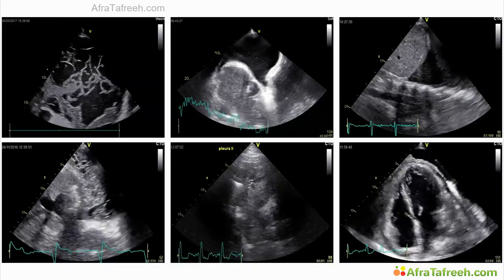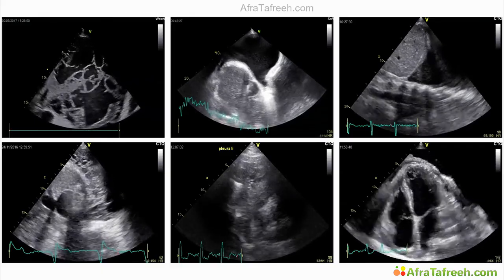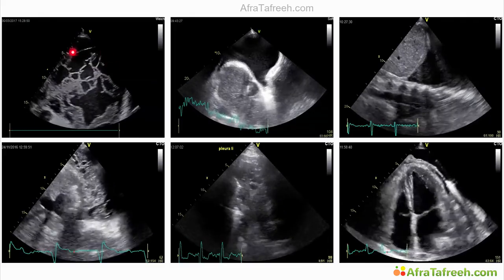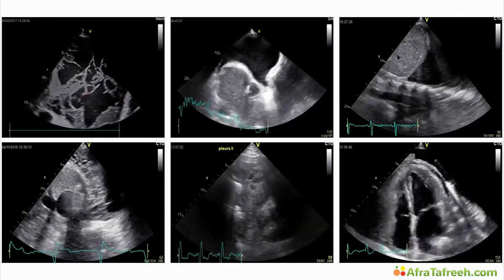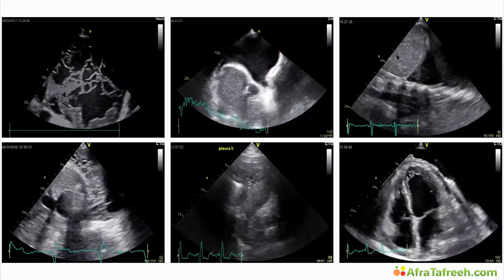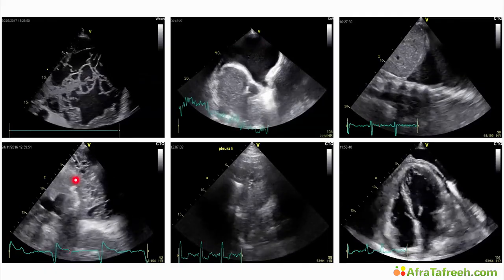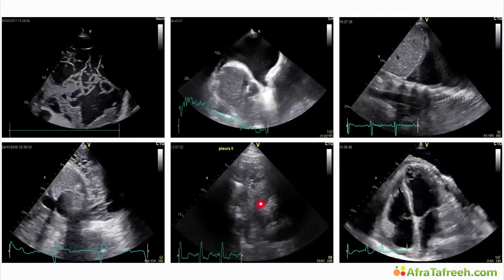Here are some other images that we took with another machine. Look how bizarre these pleural effusions at times can look. This is an exudate. Here you would have an echolucent effusion. This is a transudate. Here you would have an exudate. This would be a more organized pleural effusion already.